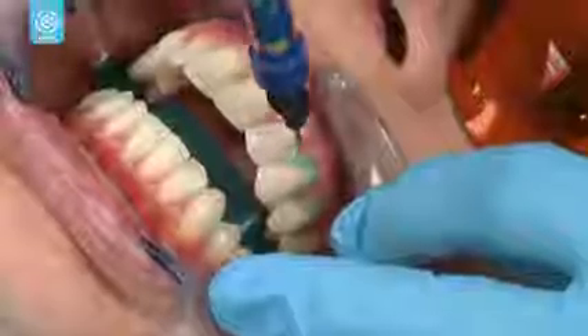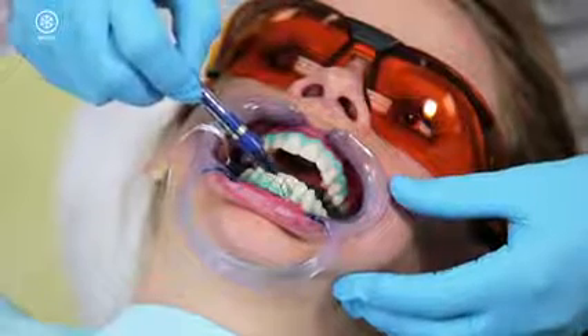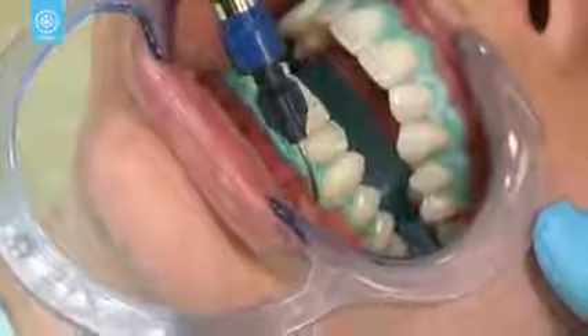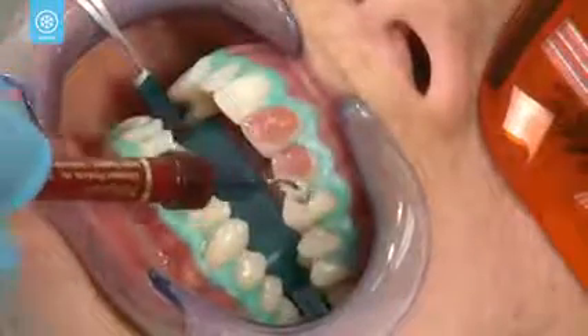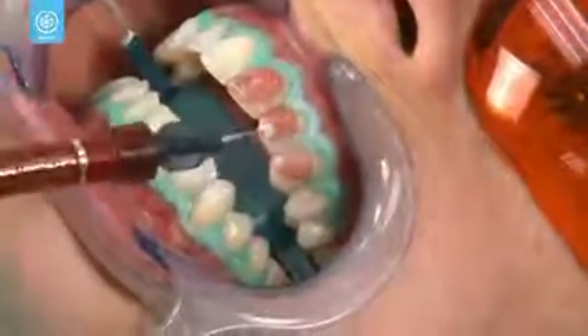A resin barrier will then be placed around your gum line. This will help ensure that once placed, the whitening gel will only come in contact with your teeth and not your gums. With the resin barrier in place, your dental professional will now apply the first application of Opalescence Boost to your teeth.